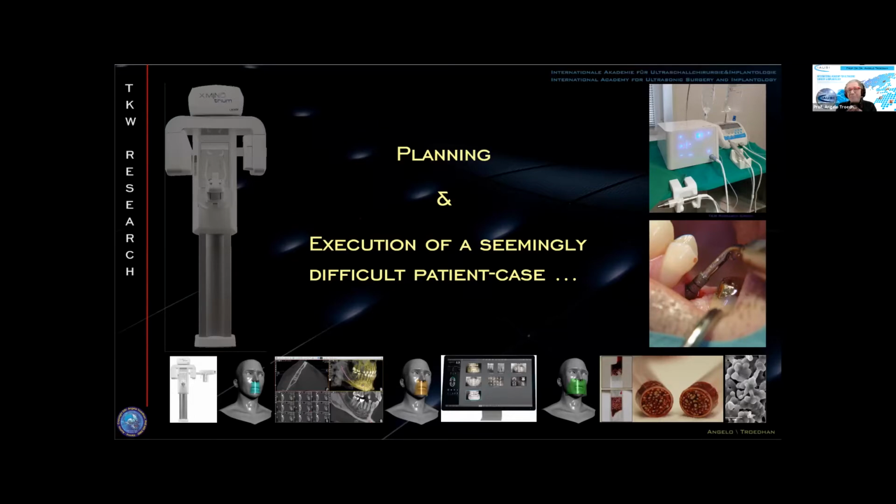But nowadays, and believe me, since I have used it since 2014, it's almost impossible to do a precise planning without CBCT anymore. Of course, the simple cases with periapical radiography, you can manage most of the time just with 2D representation. But once it comes to very common procedures like sinus lifting, I always call it INTRALIFT because we developed this patented technology.